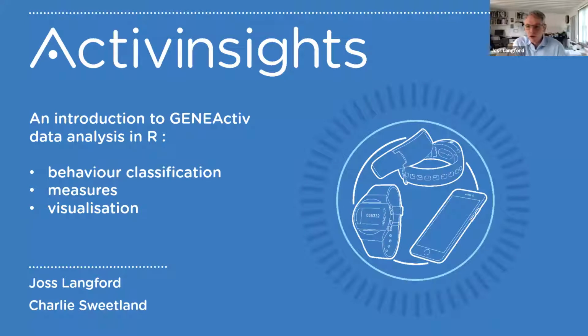So what I'm going to do is share my screen and make sure that is running. Charlie, I'm going to rely on you to tell me that that's all sensible and visible. Yeah, brilliant. Okay. The bulk of this presentation is going to be from Charlie, so I'm just going to do a little bit of talking at the head of this.